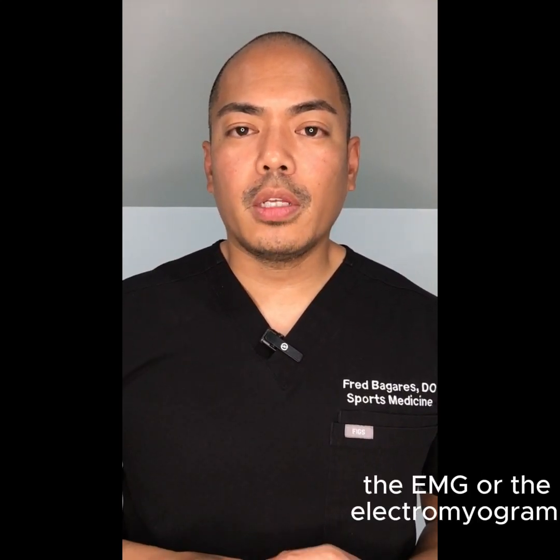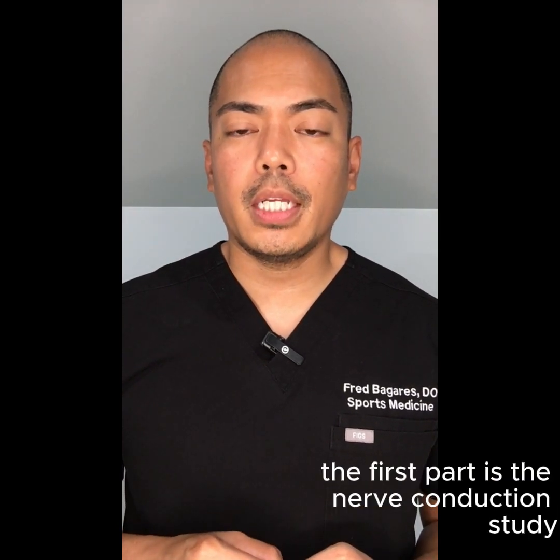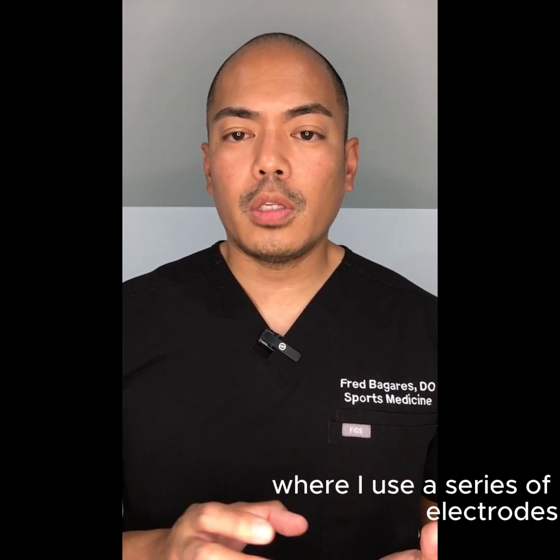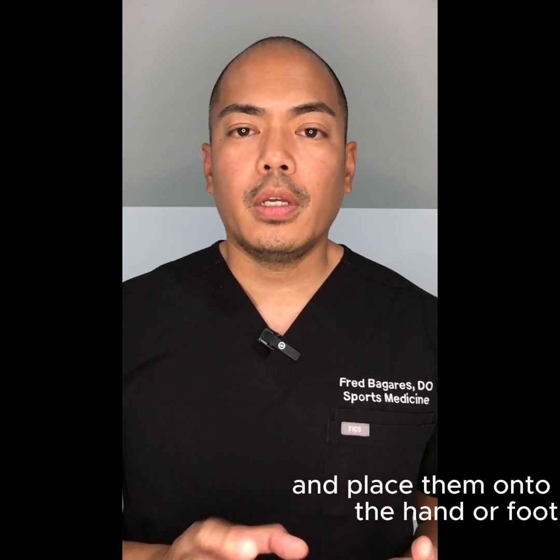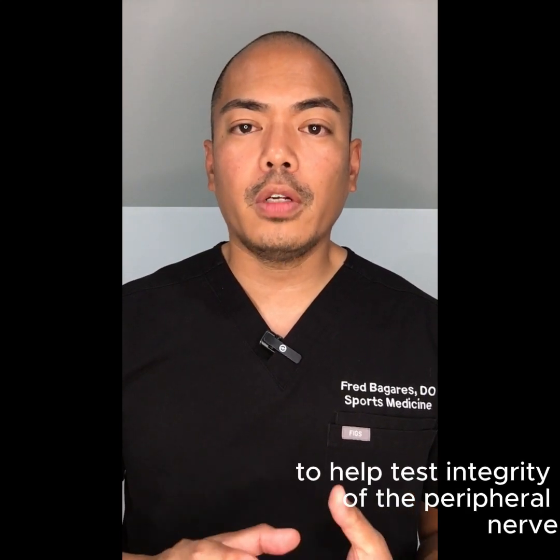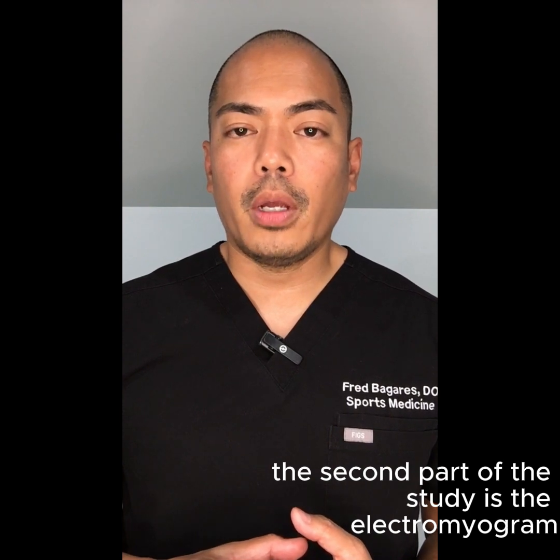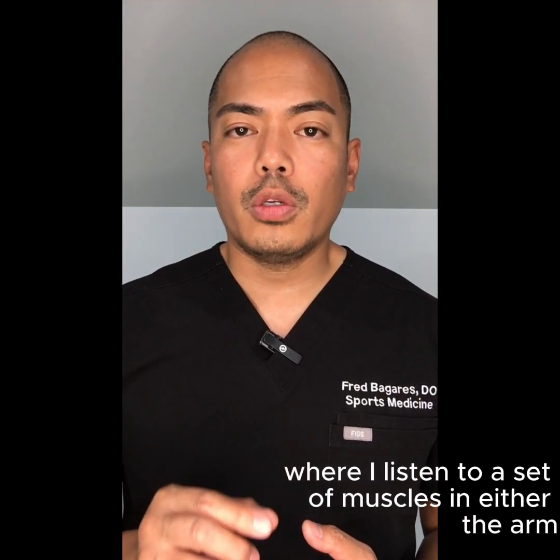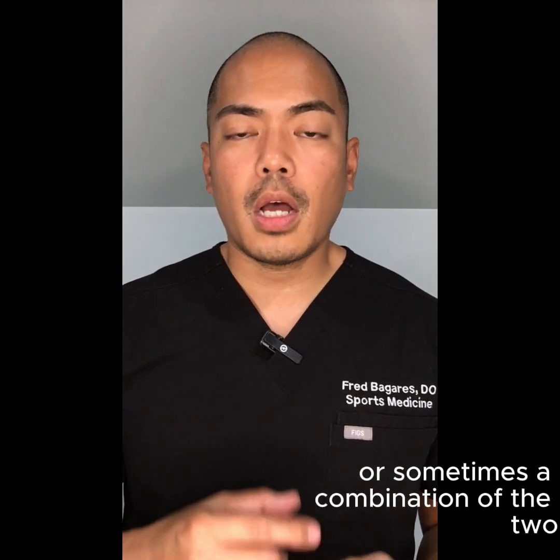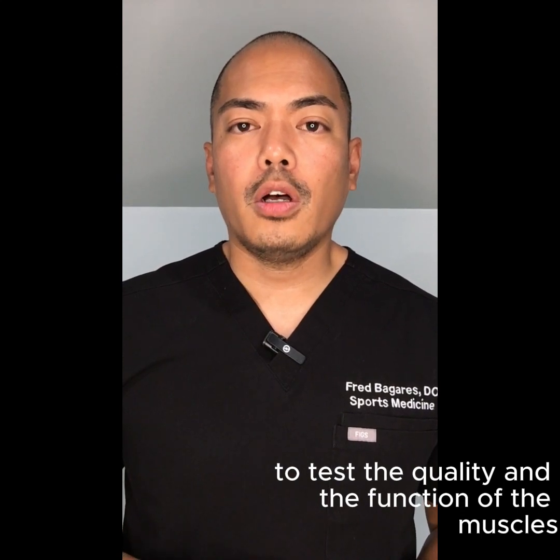The EMG, or the electromyogram, consists of two separate procedures. The first part is the nerve conduction study, where I use a series of electrodes and place them onto the hand or foot. A signal is then sent to the electrode to help test the integrity of the peripheral nerve. The second part of the study is the electromyogram, where I listen to a set of muscles in either the arm, the lower leg, or sometimes a combination of the two to test the quality and the function of the muscles.